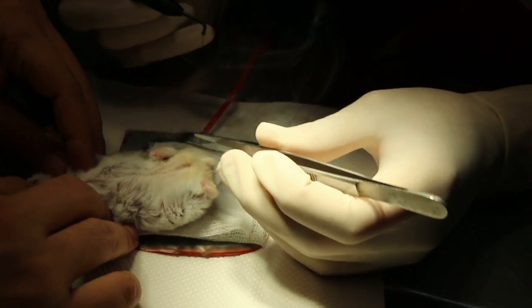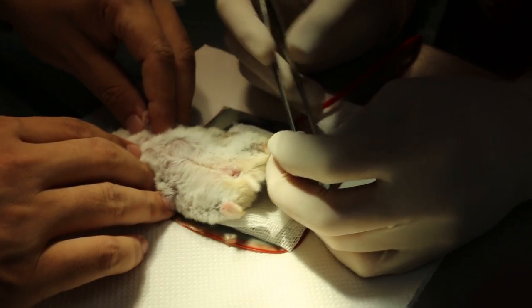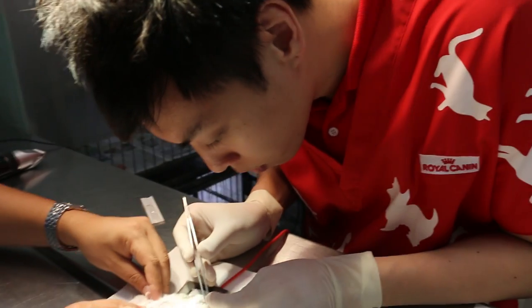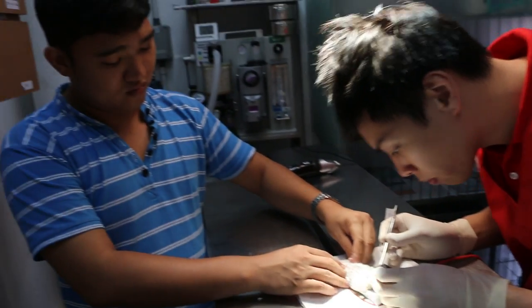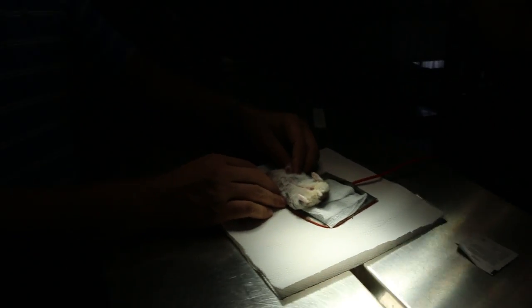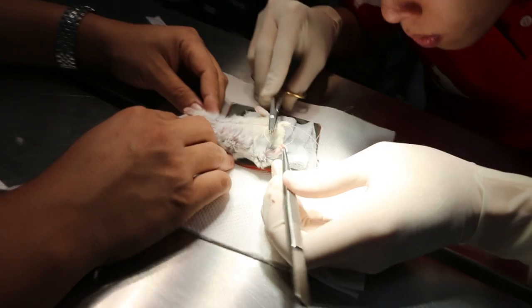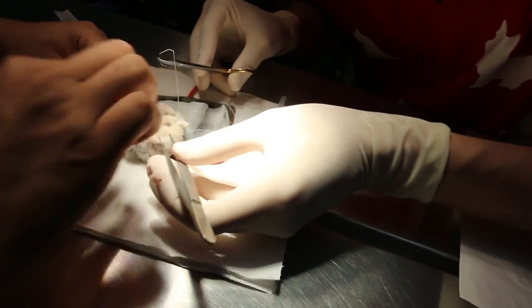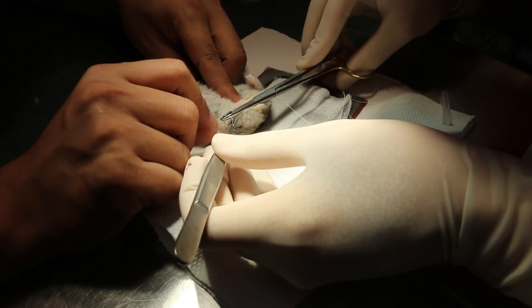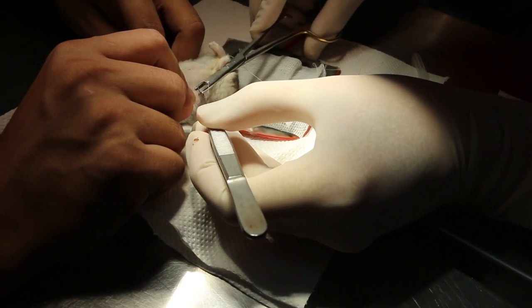Could be a wart, yeah. Okay, any stitching of this? Now we stitch at the wound, 5-0. Hold on. Help me hold the leg. Put the leg down a bit, yeah. Skin, yeah. One stitch.